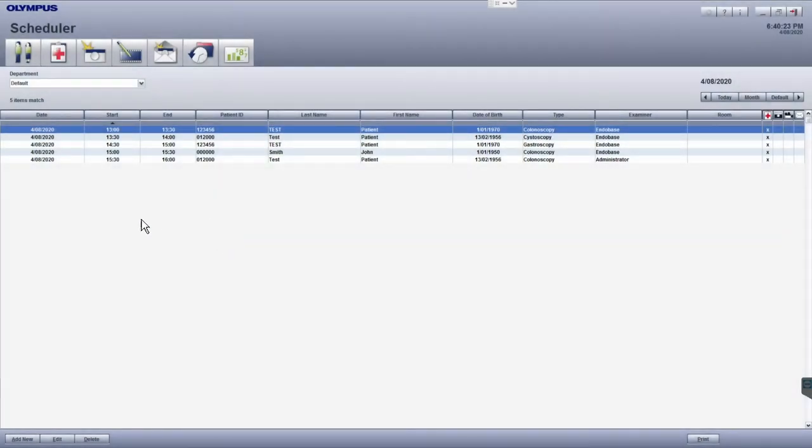If your endobase system is integrated with your hospital information system, your list of examinations can be set up to populate automatically. Alternatively, you can manually add examinations to your list.